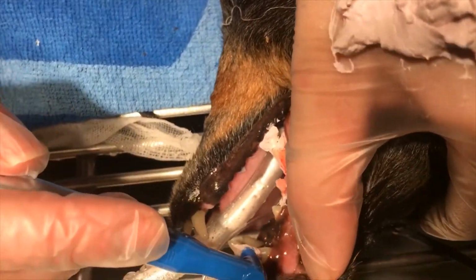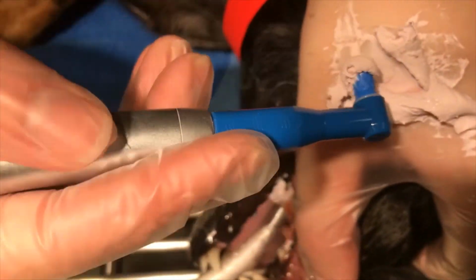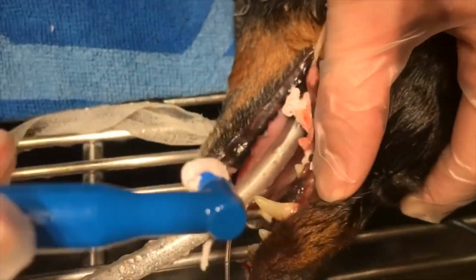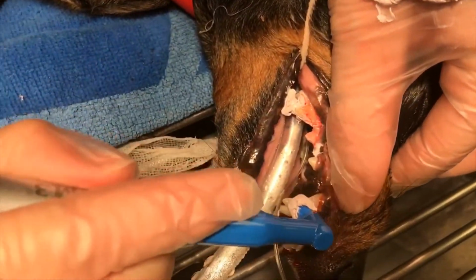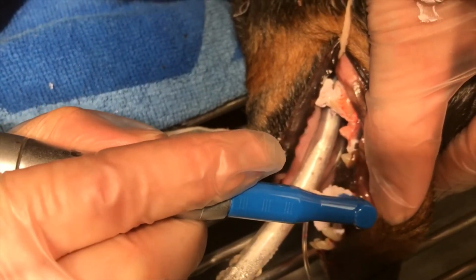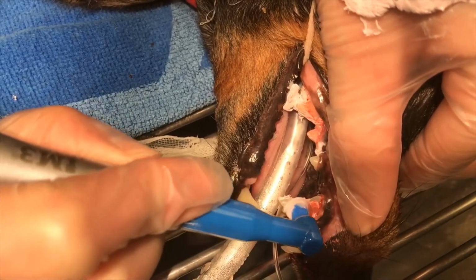The reason why you would apply prophy paste is that after you scale, you've made little microscopic crevices in the tooth that you want to smooth out. This is like sandpapering it down, making it smooth. That would help prevent plaque and tartar buildup as quickly as it would gather otherwise, as you were taking away those little crevices that they would grab onto and hold on.